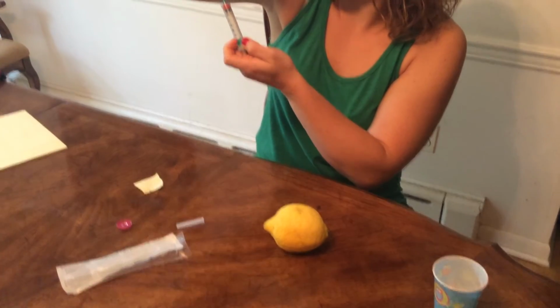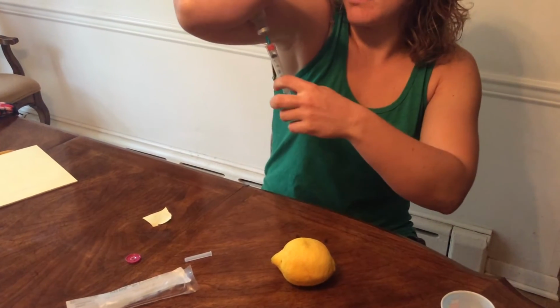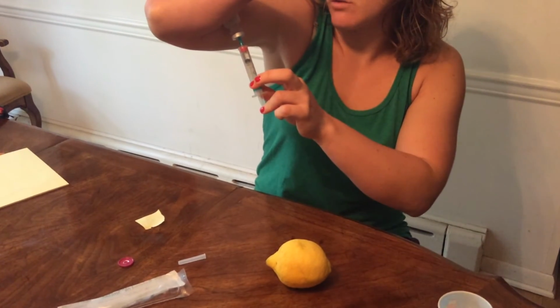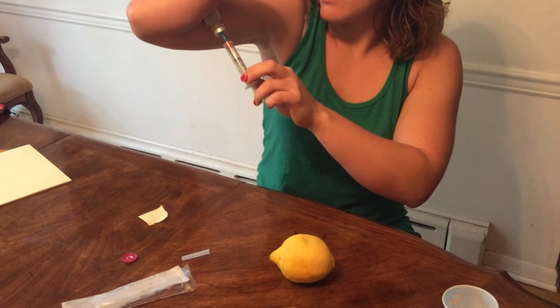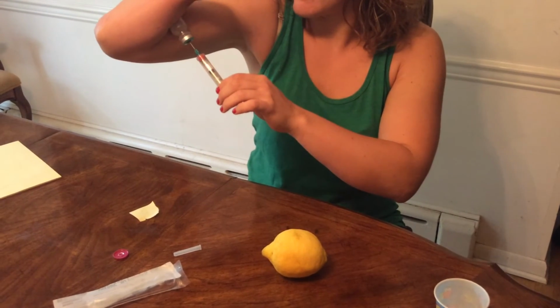So I'm just going to go in, take out 1 cc. So when I'm doing that, I just grab at the bottom here, using 2 fingers to hold the needle, and I take a little bit extra, okay, because you're going to be pulling some of it out. Okay, so it's below water level and you're pulling some of it out.